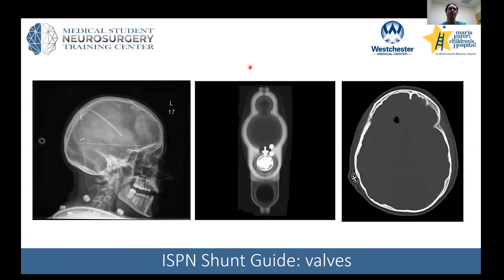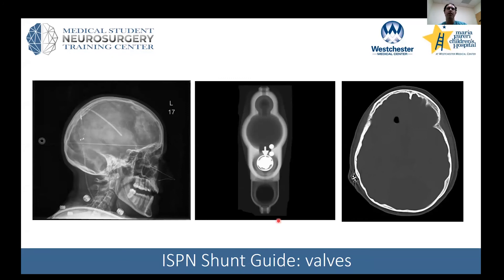Here are some examples of shunt valves. With a lateral skull x-ray you can usually get a good look at the markings — the catheter going into the ventricle, the valve, and then the tubing tunneled to the abdomen or another body site. Axial bone window CT can be very helpful to trace the valve and tubing. The International Society for Pediatric Neurosurgery has a website called the Shunt Guide, which covers commonly used valves, their radiographic appearance, and pressure settings — a great resource to bookmark for when you're an intern sorting out which valve a patient has.